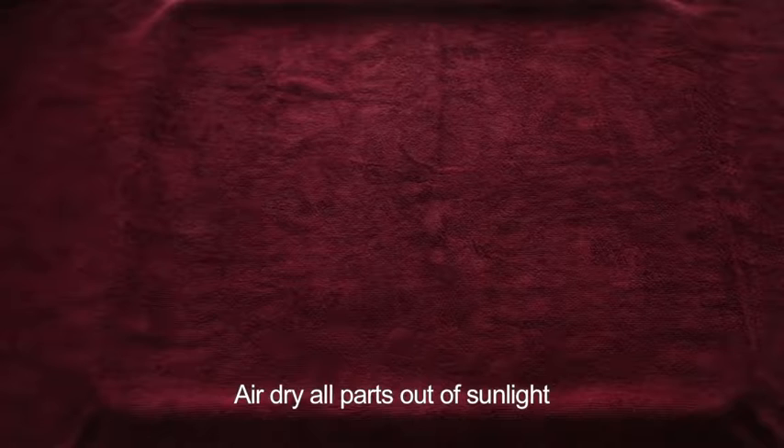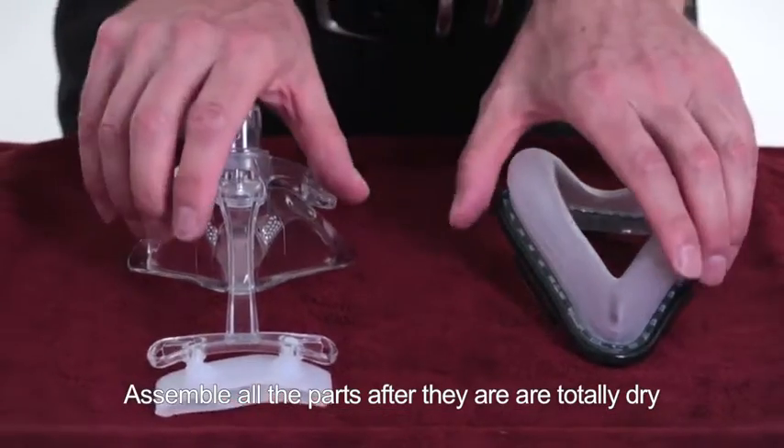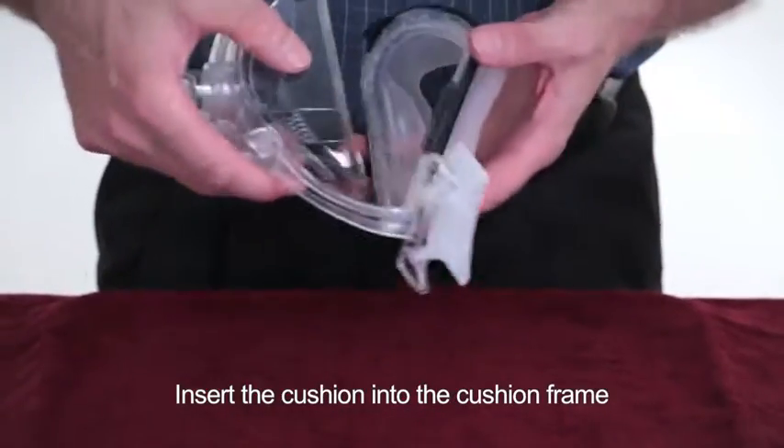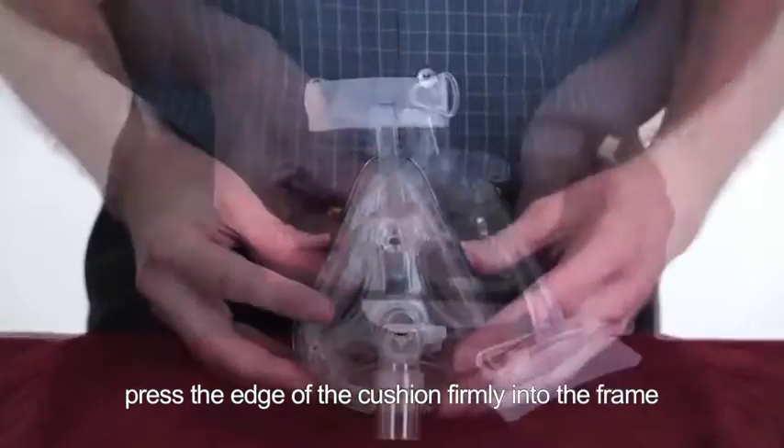Air dry all parts out of sunlight. Assemble all the parts after they are totally dry. Insert the cushion into the cushion frame and press the edge of the cushion firmly into the frame.